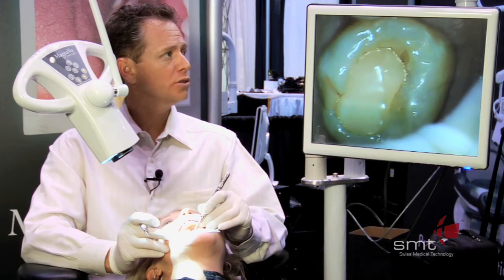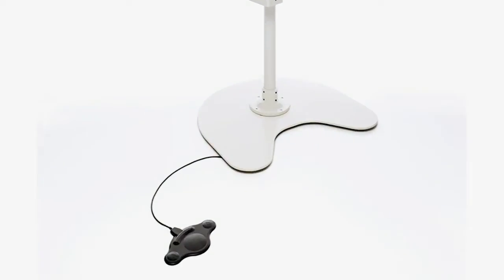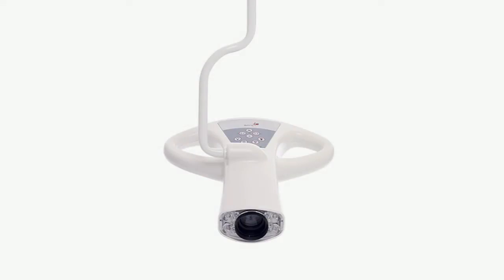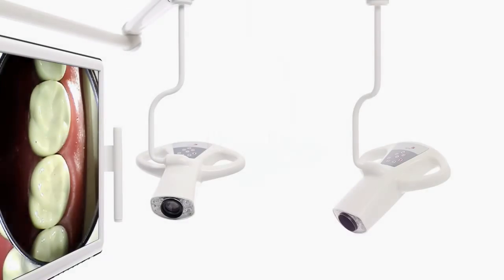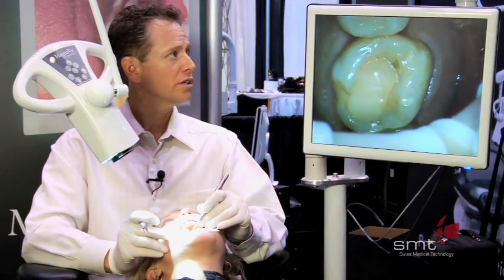With the Dentaloscope 2D, you're able to take before, during, and after pictures using your foot pedal. You can hook it to a DVD recorder and record your entire procedure. You can connect it to your computer software and input these images into your software programs. It's just very, very useful as far as diagnosis and treatment.